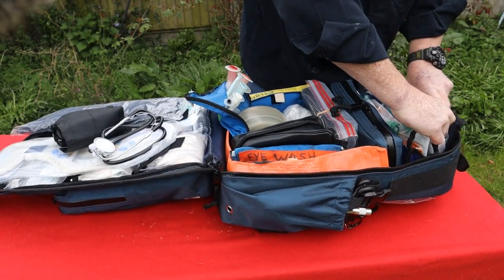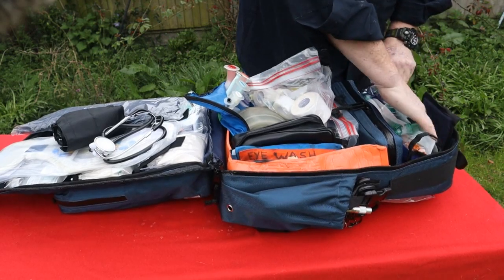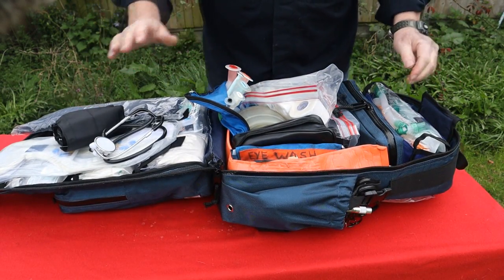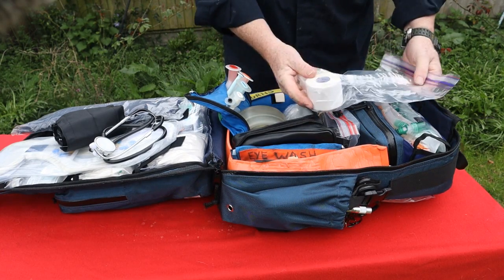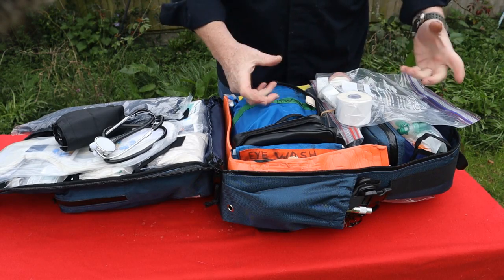Still talking about basic life support, people. So suddenly we've done airway, breathing, circulation, arrest major haemorrhage, all out of this bag. I always have a big bag of assorted tapes. I like plaster. Given a choice, I'd just have a big bag of plaster.